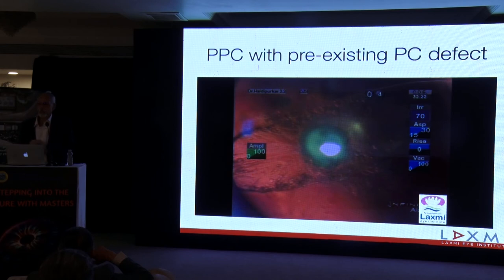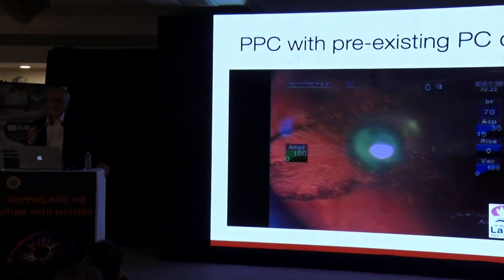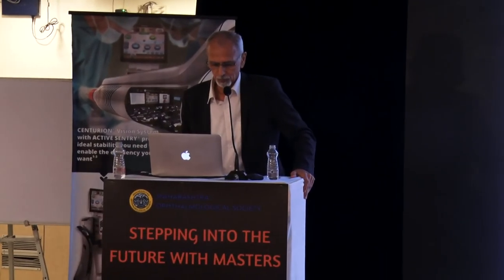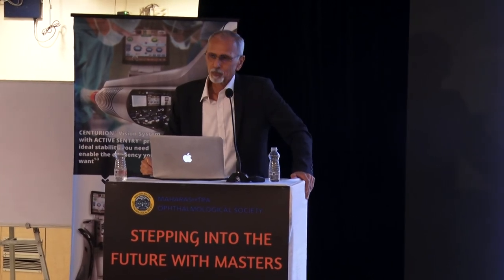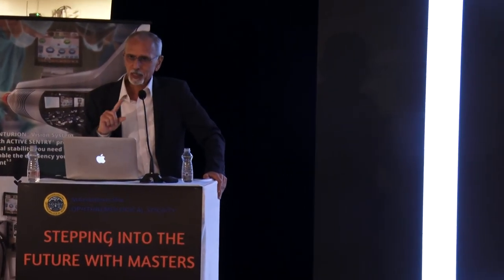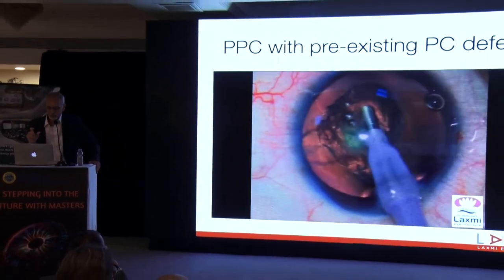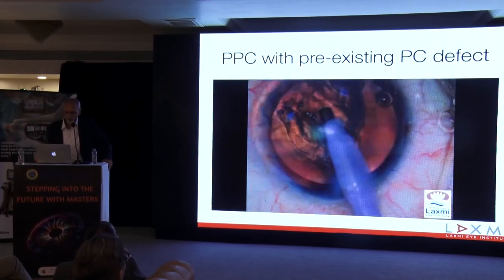So if you can make sure that while you are operating, you don't disturb the vitreous, most of your cataract part you can do without needing vitrectomy. And finally, when only a small bit of epinucleus or cortex is left, and if you are required to go for a cutter, it doesn't really matter because there is less chance of anything falling into the vitreous. So these are the cases where you obviously do not use a single piece, so you are prepared for a three piece, so your capsulorhexis size cannot be too small or too big because you would like to do optic capture.